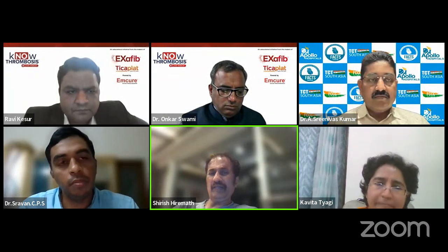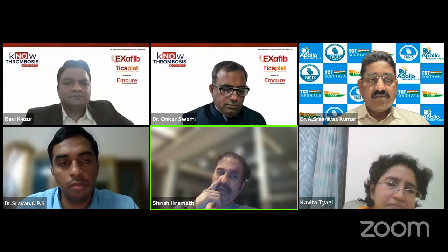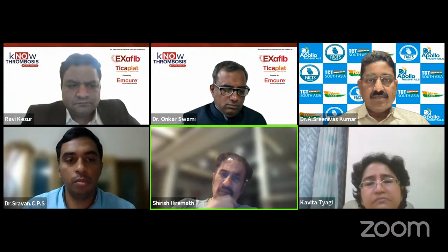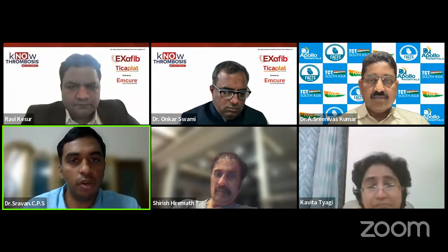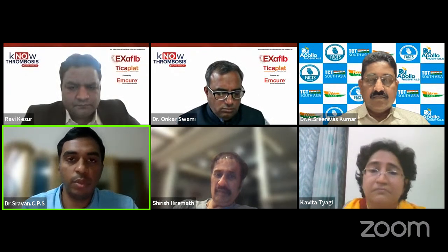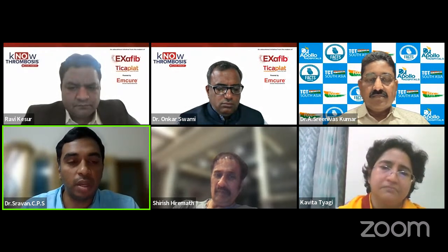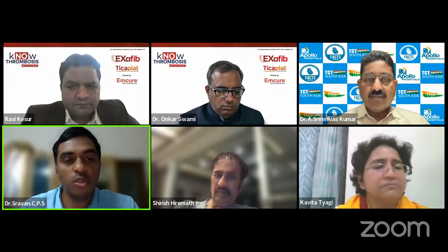Are there any tricks to use IVL? What is the biggest diameter IVL balloon that comes for coronary? We have only 4. So in periphery, what are the IVL balloon diameters? They have even launched one for the below-the-knee leg segment now, sir. I haven't tried that segment. This was with the first generation balloon, quite some time back. It was a colleague's case, and I had joined him almost a year back, sir.